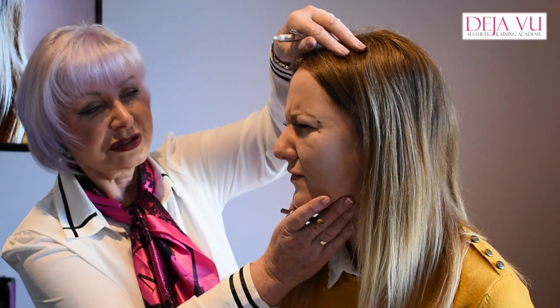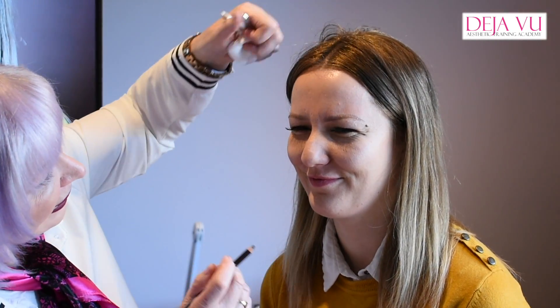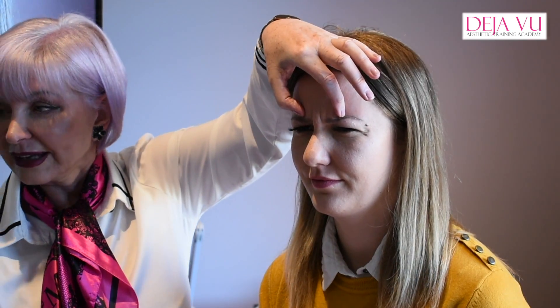Sophie, can you turn around towards the camera again? Okay, so I can see the muscle pull from there — relax.